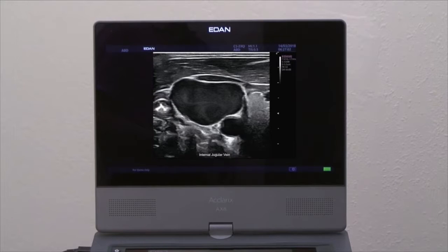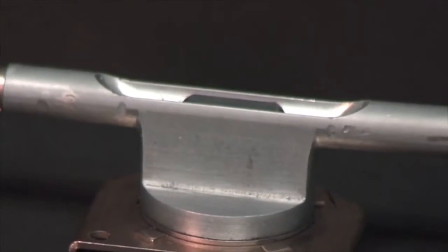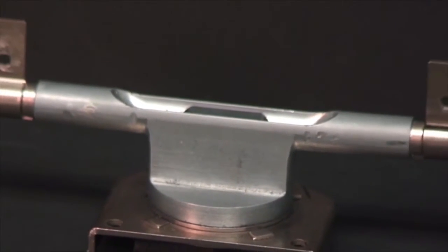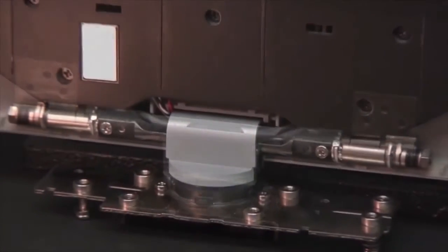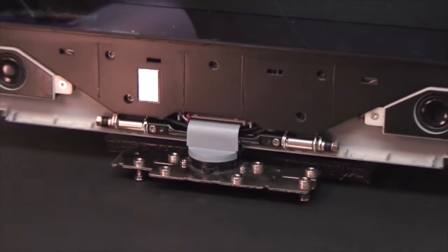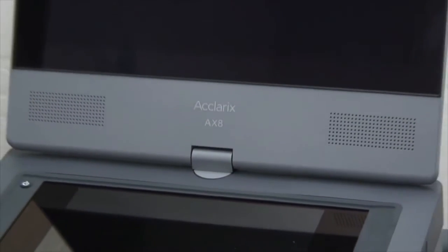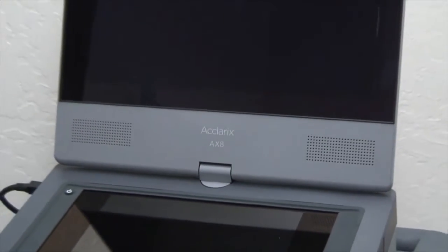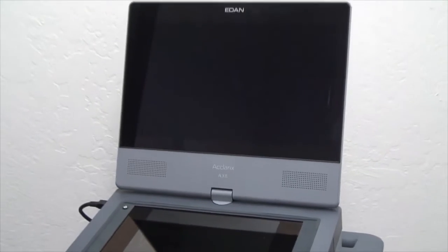The 15-inch monitor is a very high-quality, high-definition monitor for exceptional grayscale contrast and color display. The hinge on the monitor was specifically engineered for the system and cycle-tested through tens of thousands of activations, ensuring durability.